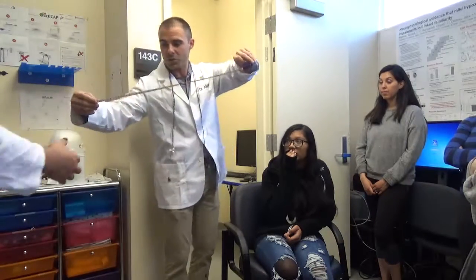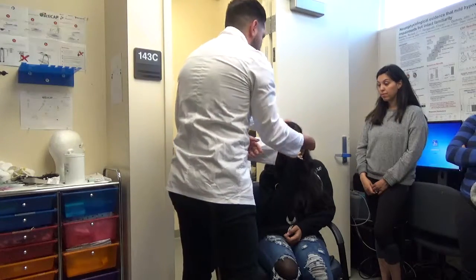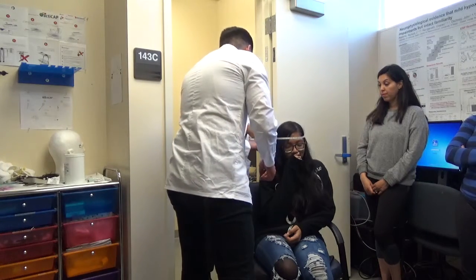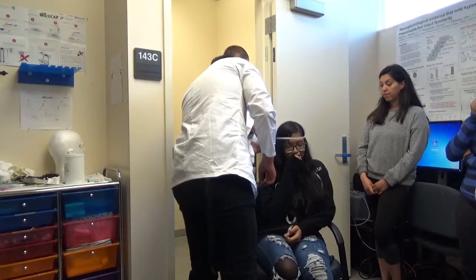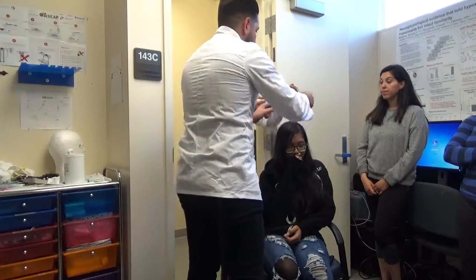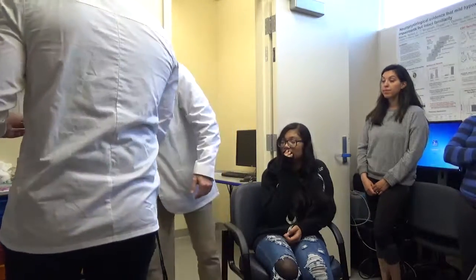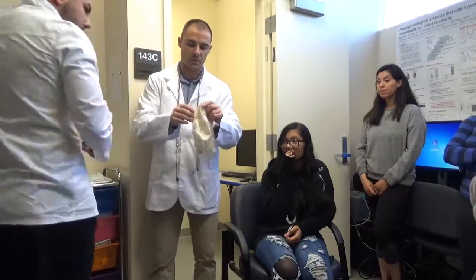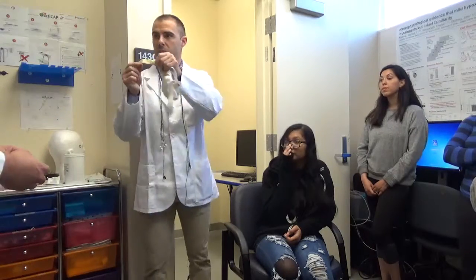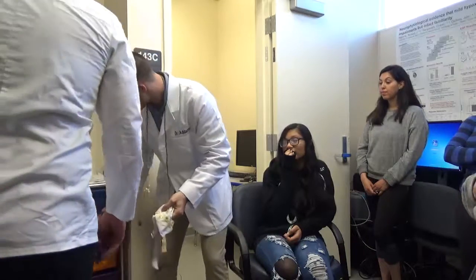Just some obvious stuff, but sometimes we forget that. You want to help me measure her up? Now we measure in centimeters, so we're just going to go around the crown of her head. This way? Yeah. There you go. So what does that read? 57? Okay, 57. Perfect. So you press that little button, it retracts. You want to look and find the cap that's 57. They're on the back of these labels. Which one was that? 54. 54, okay, so no bueno.